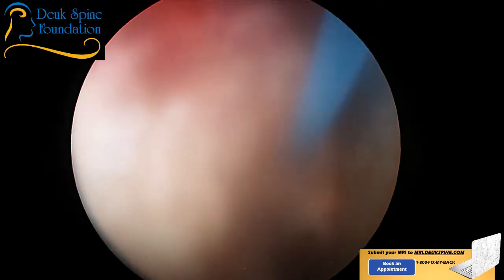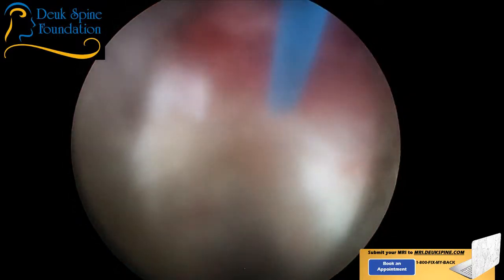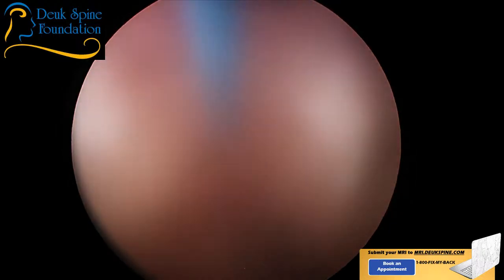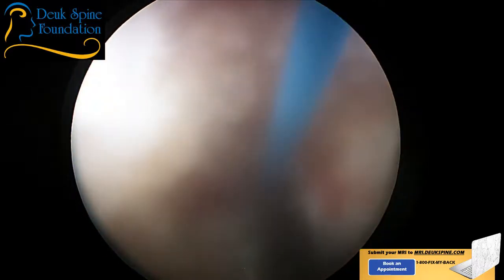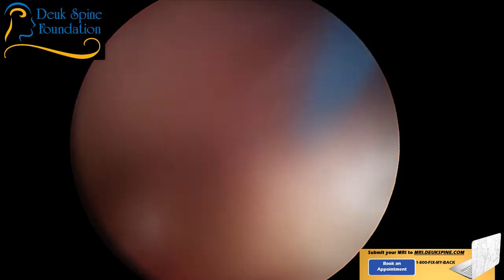Okay. We're at the back of the disc, in case you're wondering. This is the back of the L4-5 disc. That's the epidural space. Again, veins. And really, there's not much disc left. It's all pretty much empty, right? Except there was that one little thing. And that one little thing was the annular tear.